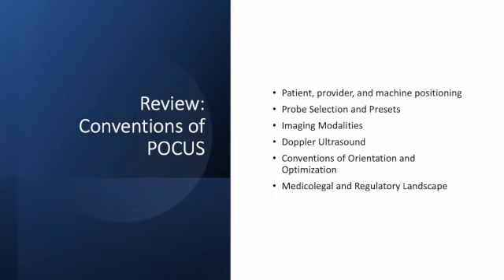Welcome back to the Waco Family Medicine Point of Care Ultrasound curriculum. In our last session, we talked about some of the conventions of point of care ultrasound. We talked about how to place the patient, the provider, and the machine in the correct positions so that you can get appropriate images without straining or trying too hard to reach all of the different places that you'll need.